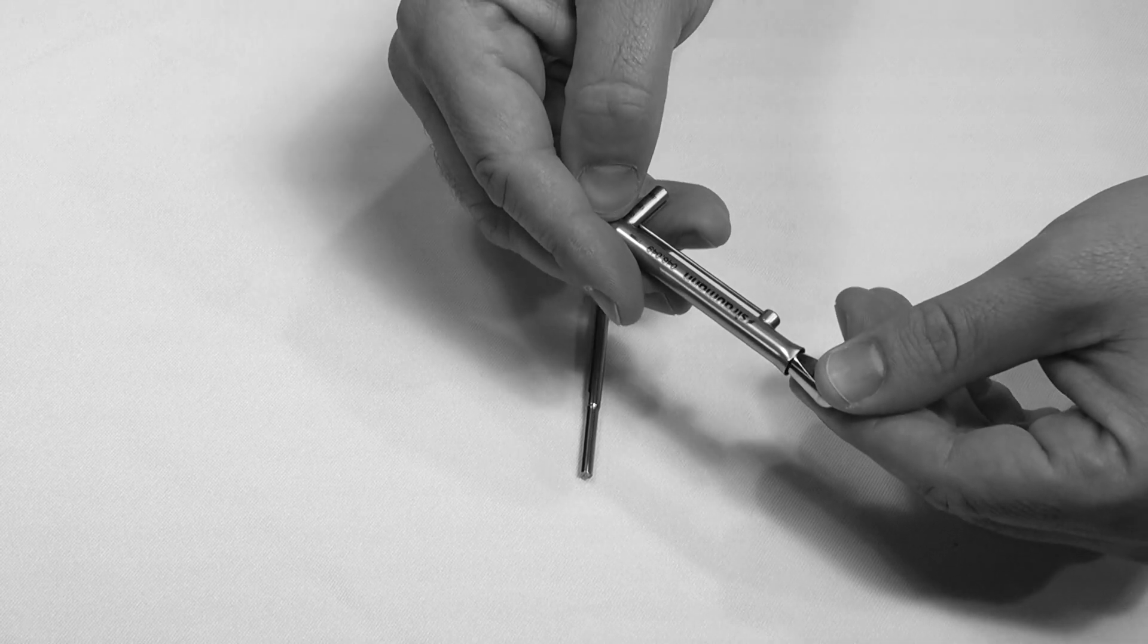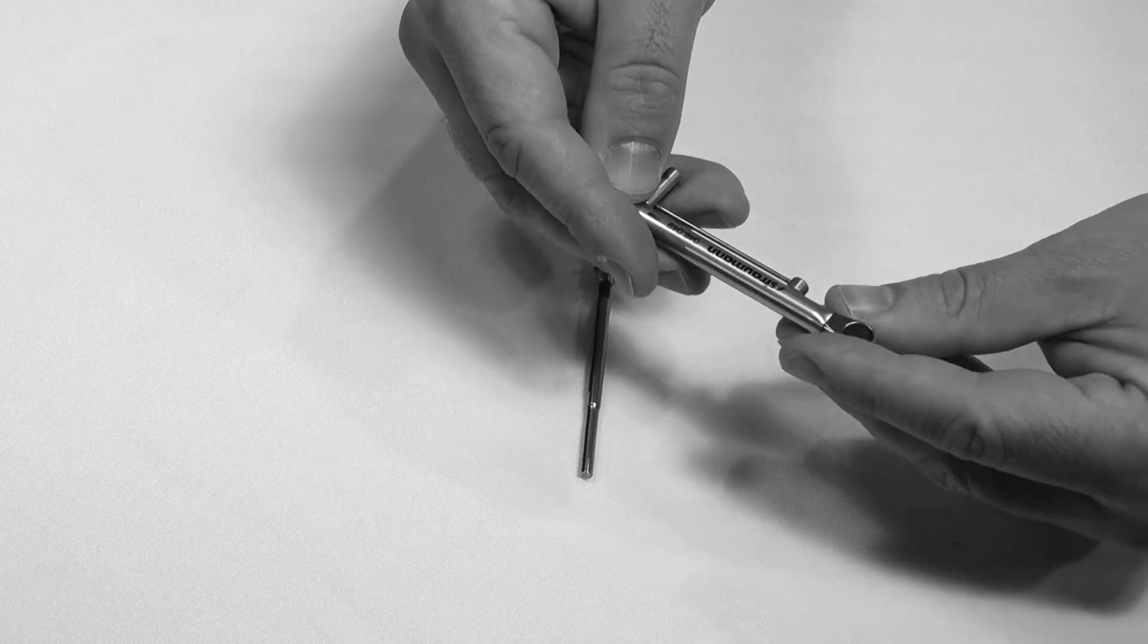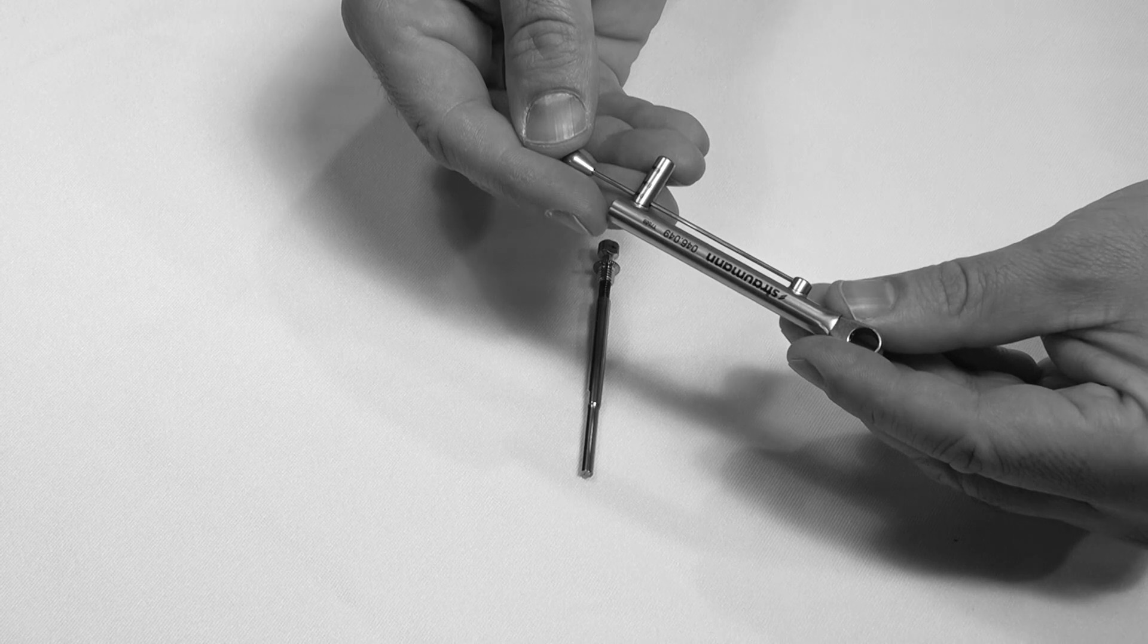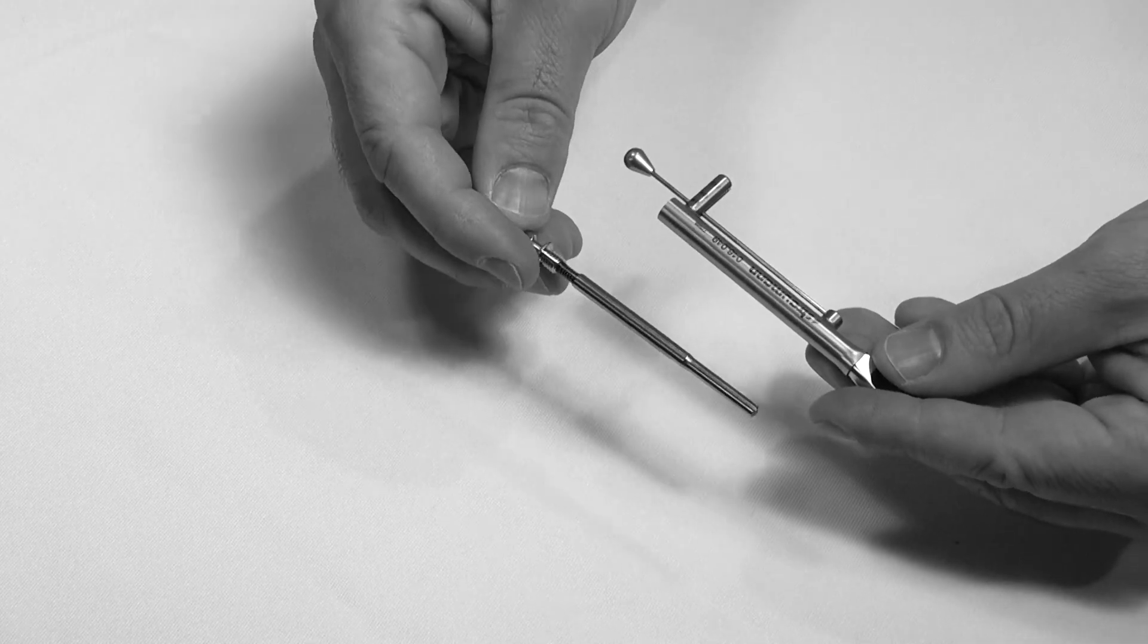First, insert the ratchet into the torque control device. Note that the round head of the ratchet is to be inserted into the flared end of the torque control device.